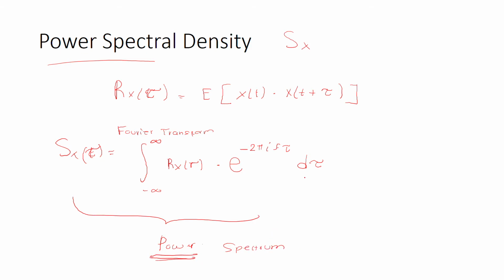So if you try to determine what the power is on each frequency band, it will tell you something about the mental state that you want to describe. So how do we compute the power spectral density? Well, there are a lot of methods, and one of the most widely used is the Welch periodogram, or Welch method. It consists of averaging consecutive Fourier transforms of small windows of the signal.